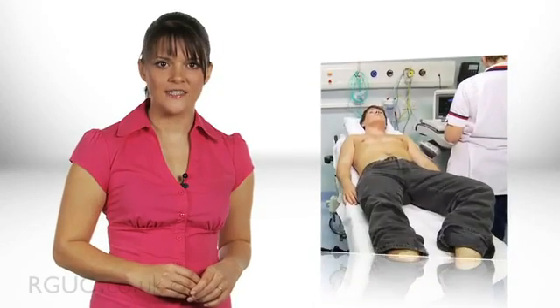While you are preparing the equipment, ask the patient to remove their clothing to expose their chest and arms. Ensure that socks or tights are rolled down or removed to gain access to the ankles. Once you have prepared your equipment and your patient has undressed, ask the patient to lie on the examination couch or bed. This should be flat with one pillow.